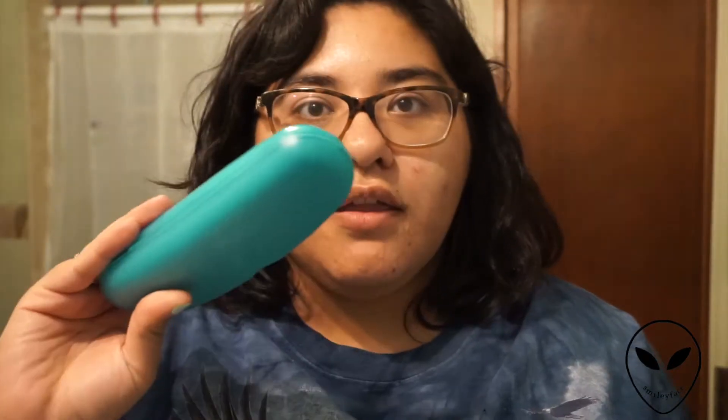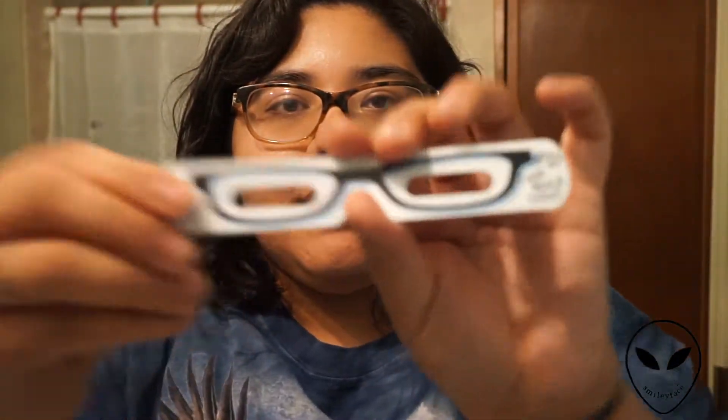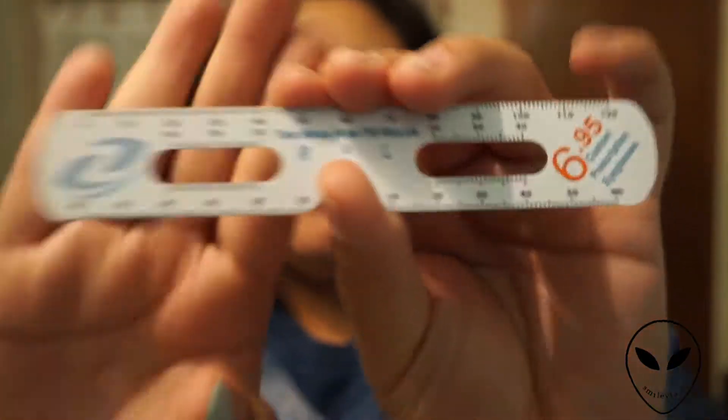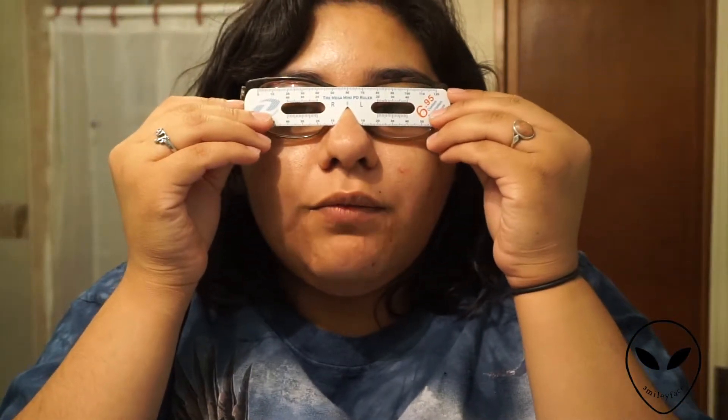I did go ahead and open the packaging because it was pretty hot and I had to go get scissors. So I ordered two pairs — there's one case and another one. They also included what looks like a PD ruler on the back, so you can measure your pupil distance at home instead of having to get a separate ruler. That's pretty cool.